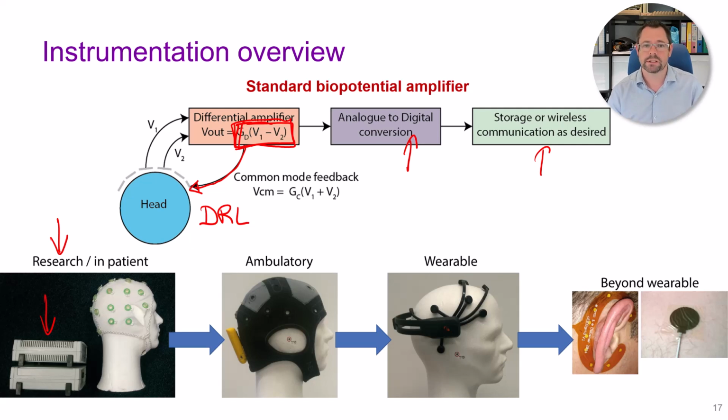Certainly for my work, we're much more interested in portable measurements, in doing studies out of the lab, in the home environment maybe, where people get stimuli which aren't present in a clinical or research setting. For that, there have been ambulatory EEG units available for a while now. These days, these are typically small enough to fit on the head itself.